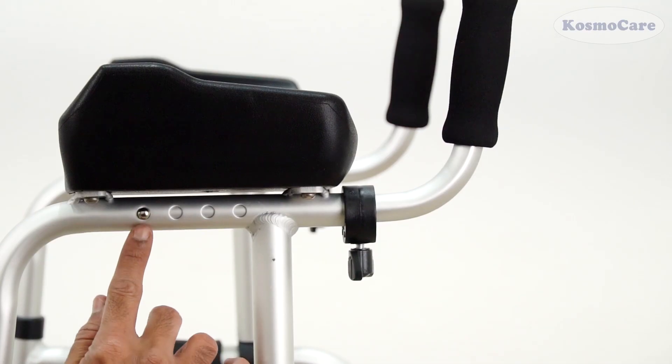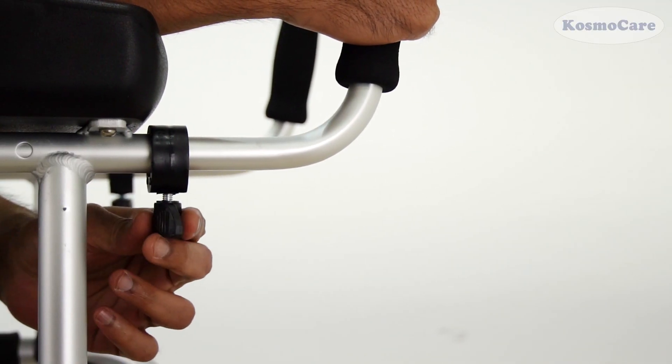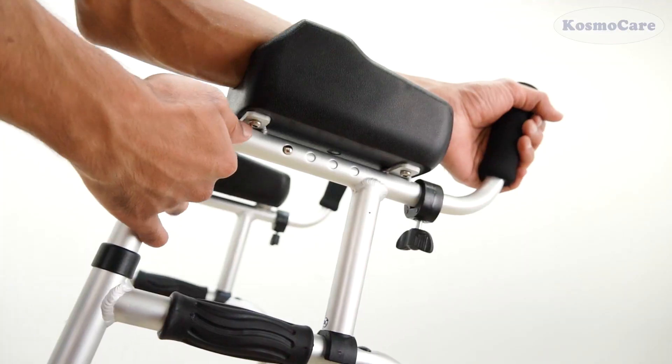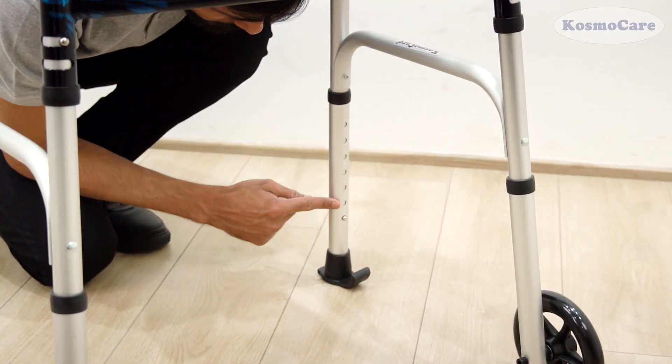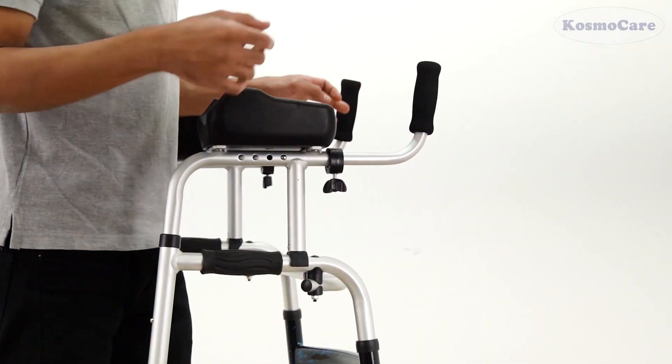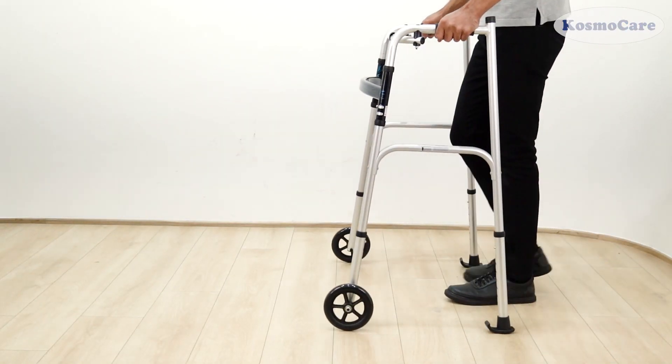The PU padded forearm support is thoughtfully designed for comfort and functionality. It seamlessly extends, catering to the size of the user's hand. Additionally, the height of the Walker can also be adjusted, enhancing versatility and ensuring a customized fit for each user.